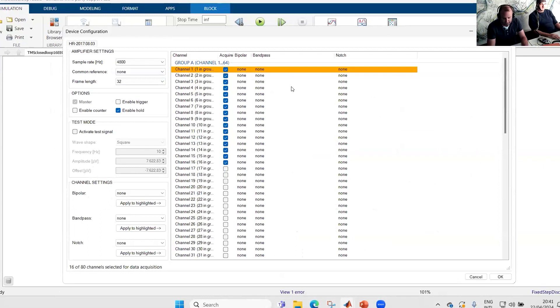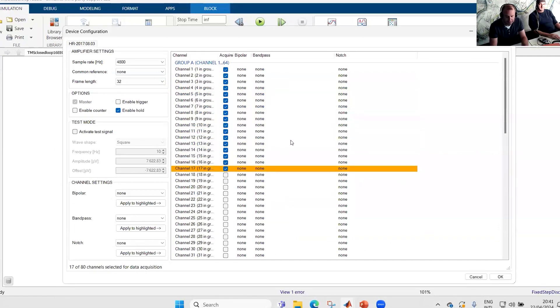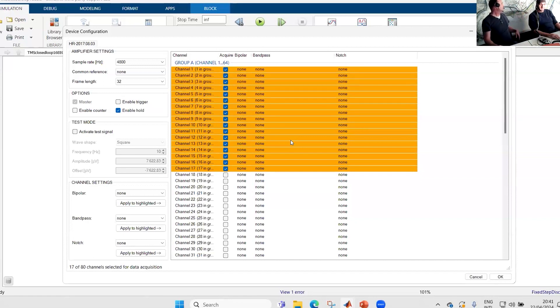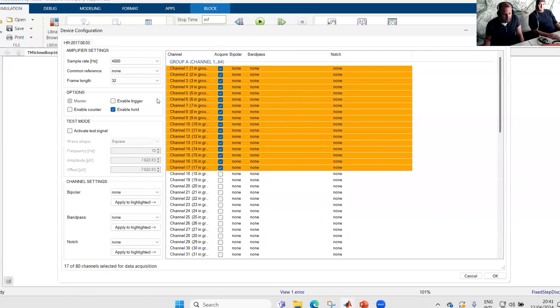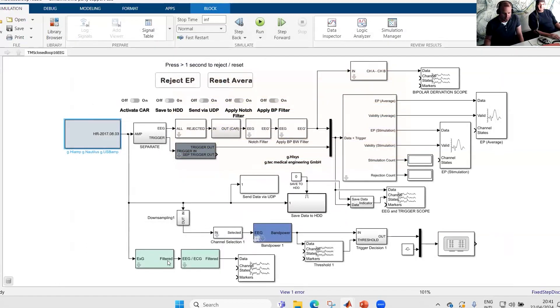With a more detailed signal we can have a better look. We choose 17 channels — before we had 16, using the same cap. One electrode is additionally in the back of the head, because for this experiment we are looking for alpha activity, for example. When you synchronize with an external device, we can also enable the trigger — so whenever we get a stimulation from the TMS device, we get immediately the trigger information that the device is stimulating. Not selecting any filters right now, because that can be done in the model. We have a bandpass filter for visualization only.